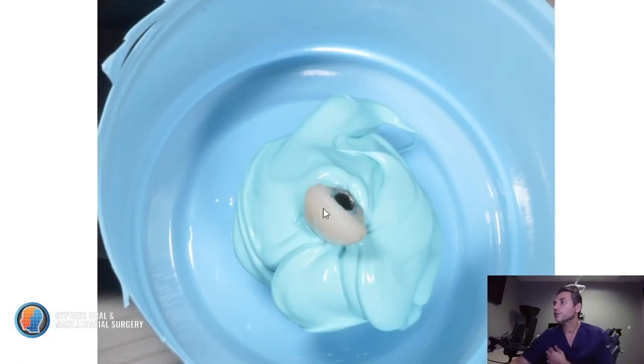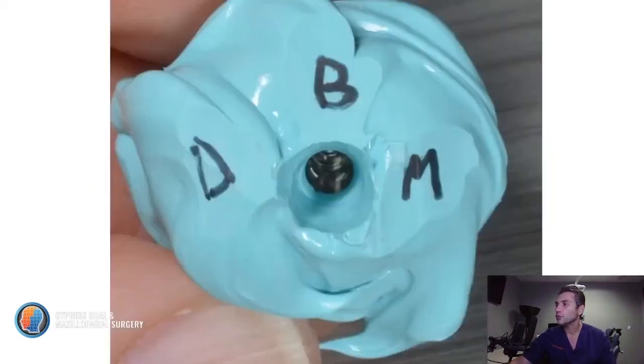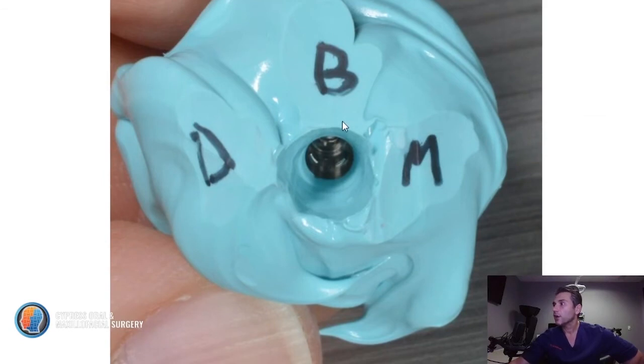The other thing here is you definitely want to mark where the buccal is, because sometimes you can get lost. So definitely mark buccal, mesial, distal, what you're seeing here. Make sure you mark it. You take the impression, you take the temporary off the analog, and this is why you don't want it to be too tight, because if you screw it in there tight and then you try to unscrew it, sometimes the analog will spin, and now you're just going to relay wrong information to the laboratory.